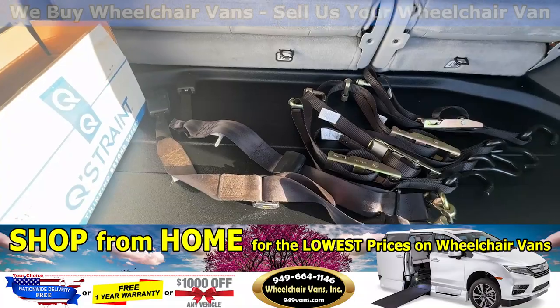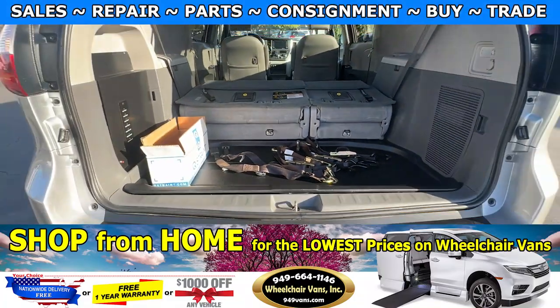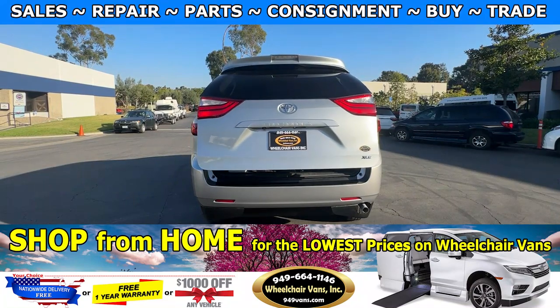As you can see, we provide everyone with a set of manual straps. If you have any additional questions, please feel free to reach out to our sales team at 949-664-1146. Thank you.